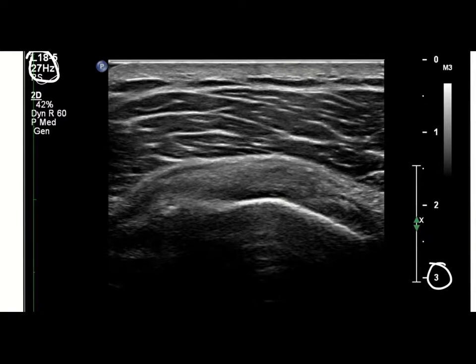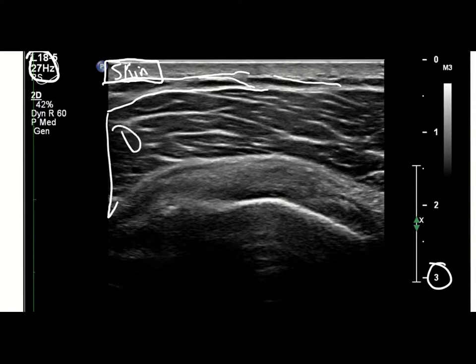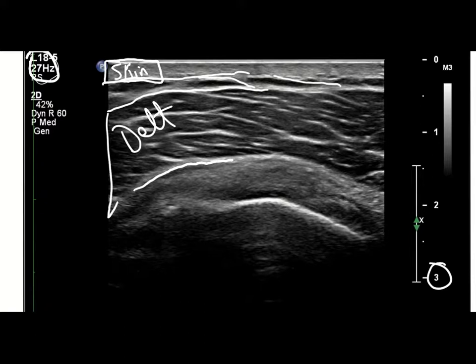Let's review some of the anatomy here. The first portion is the skin, and then deep to that we have the fibroadipose tissue — this is the adipose here and these are the fibroadipose septa right here. Deep to that we have muscle — this is the deltoid muscle here.